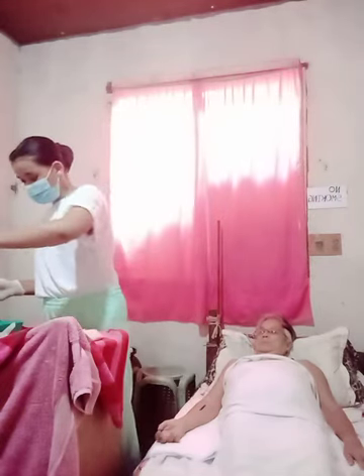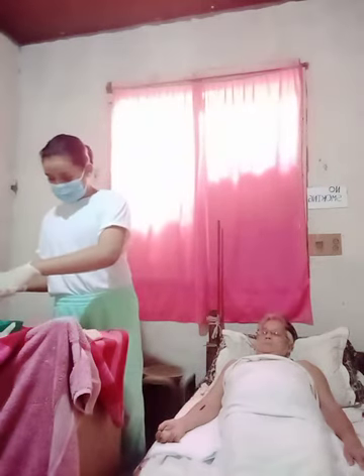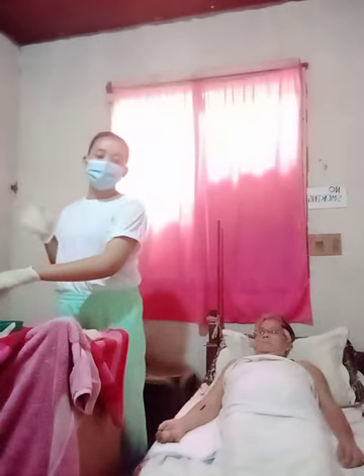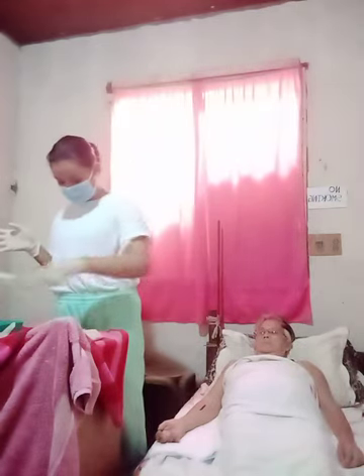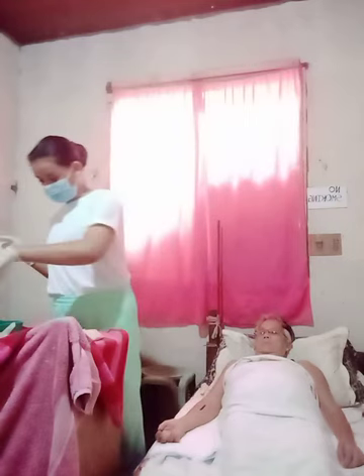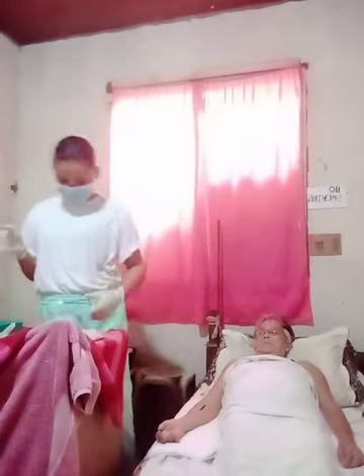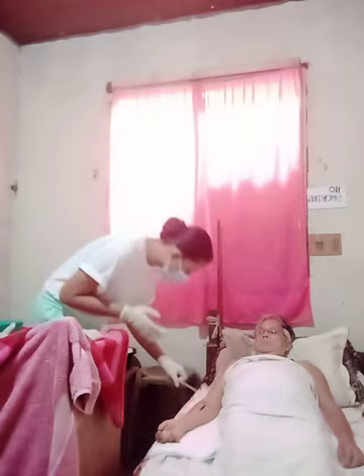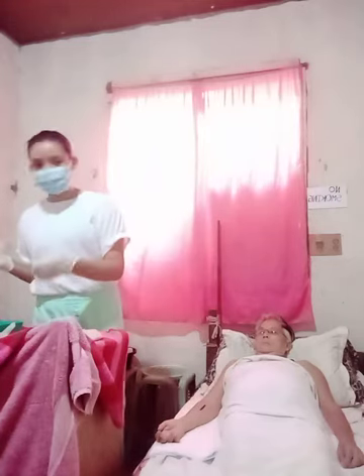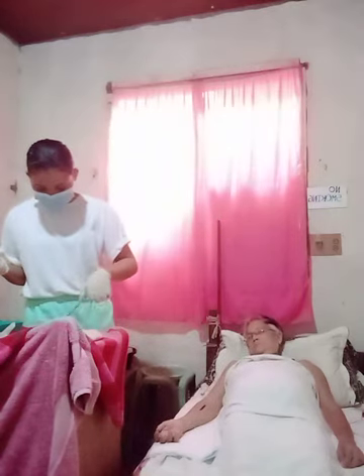Clean from the least contaminated area to the most contaminated wound area, like this. One stroke only, then put it in a waste receptacle or the kidney basin.